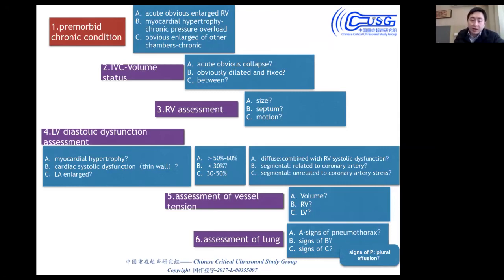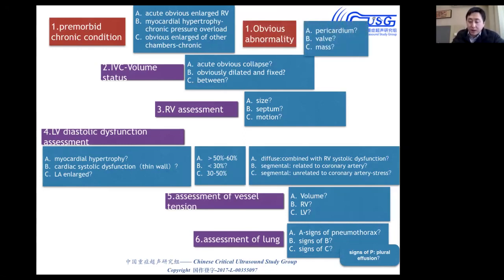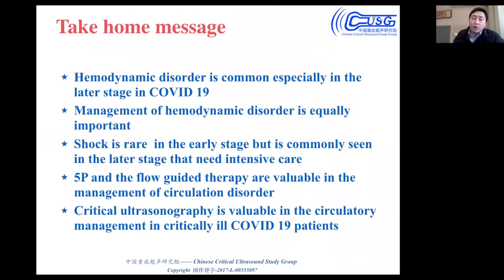That's the summary of the critical ultrasound examining protocol and the approach that we use to do the standard hemodynamic assessment, which may be very helpful for us to manage the circulation disorder of the patient, especially the patient with COVID-19. That's very important.